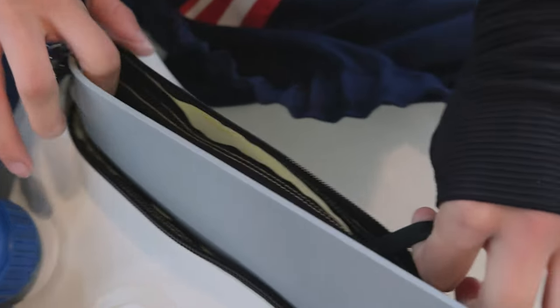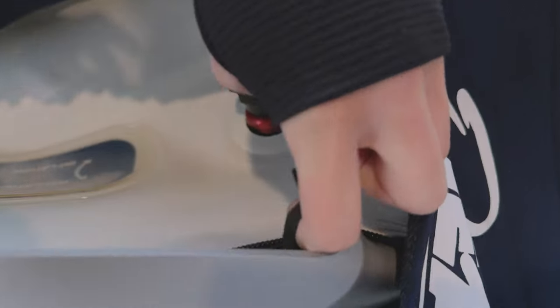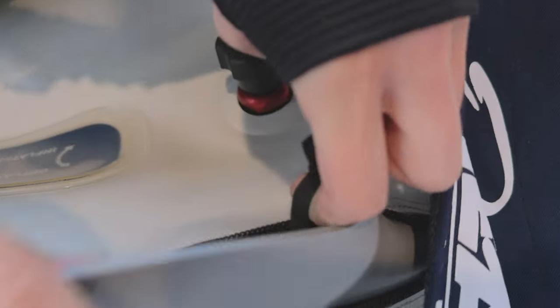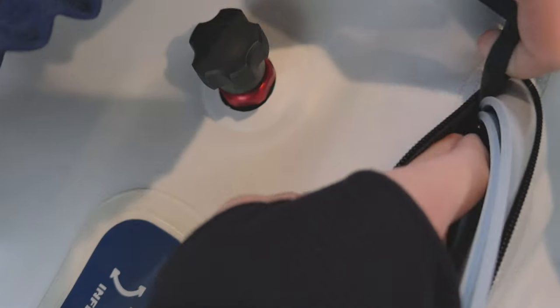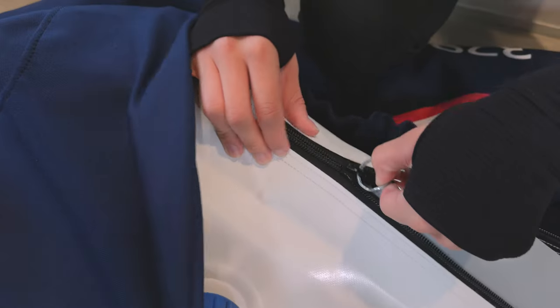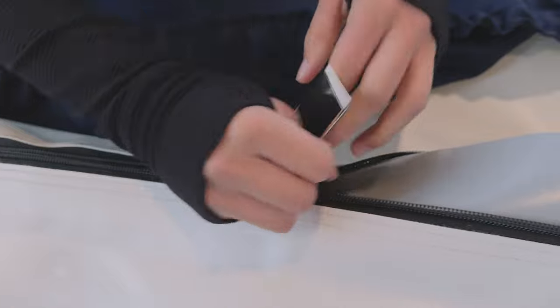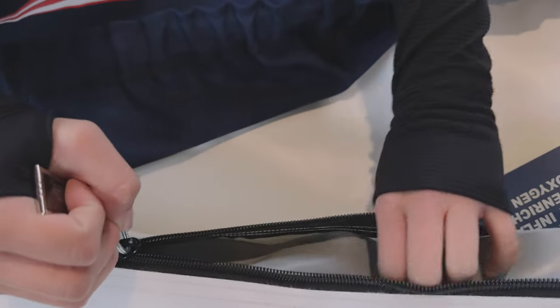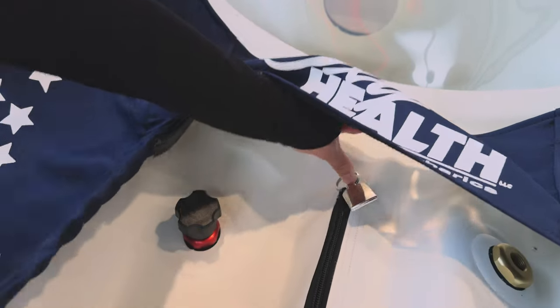Now begin to zip up the chamber — the interior zipper first. Use the nylon zipper pull that is between the gray gasket to zip it all the way to the end of the zipper track. Pay careful attention at the end to make sure it is fully closed; use your index finger to push it all the way as needed. Next, begin closing the top zipper. Tuck the gray gasket flaps flat between the bottom and top zippers, tucking and zipping. Use the metal zipper pull to make sure it is closed all the way to the end.